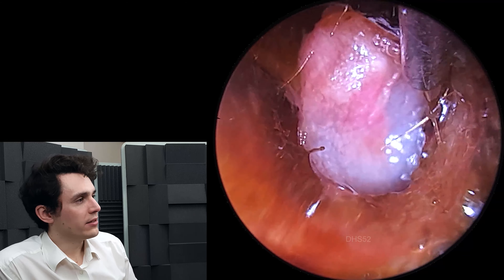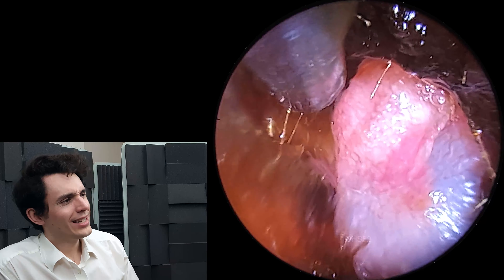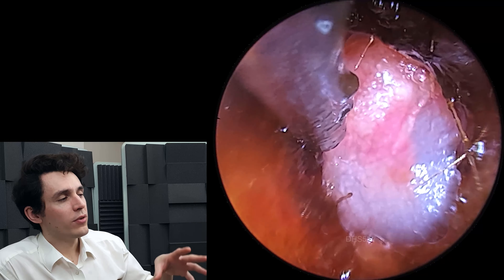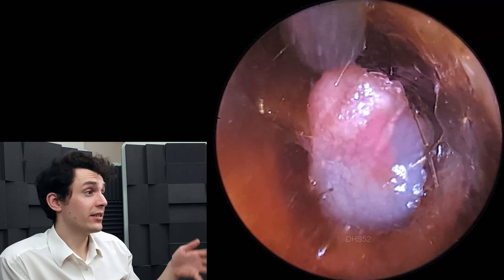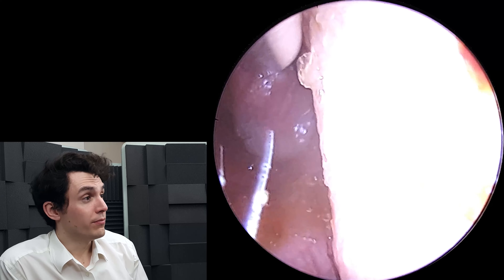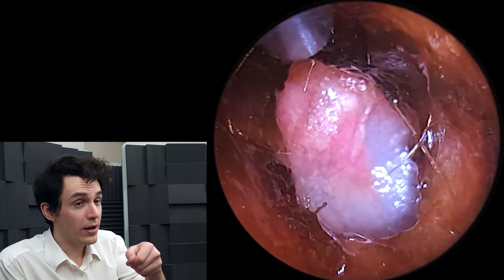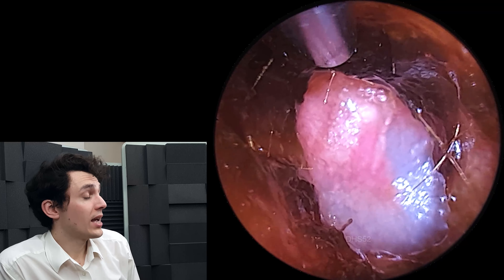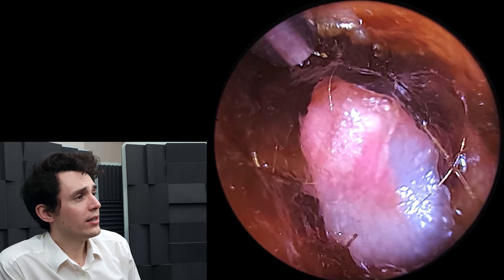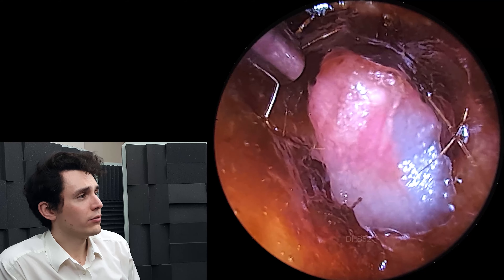I thought this was a brilliant case of just how well olive oil works. Just mopping up the sides here — the problem is you never want to apply too much pressure when you're this deep in the ear canal, as it is extremely well innervated. It doesn't take too much to make the patient jump out of their chair if you apply too much pressure trying to hoover up the slime. Just hoovering up on the roof of the ear canal here — we really just don't want to put too much pressure on the canal walls at all at this point.